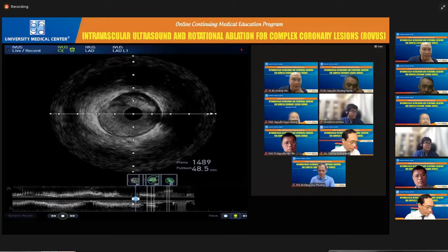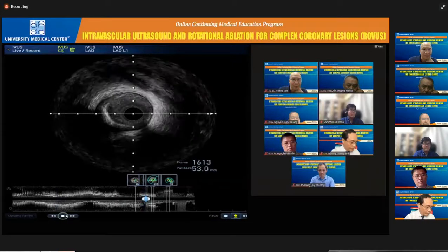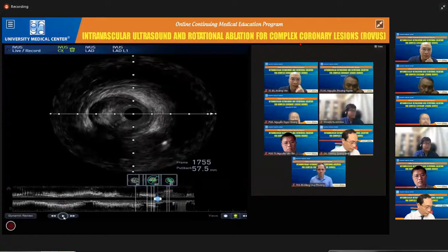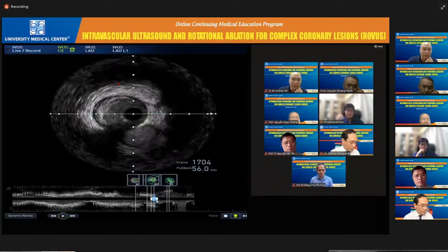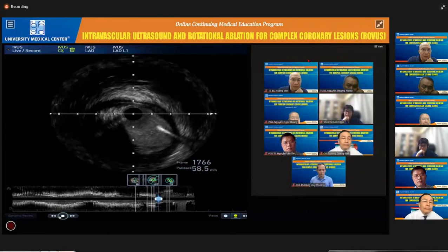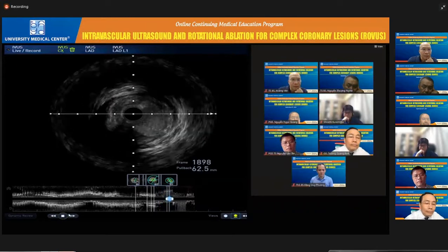Just a little bit of negative remodeling in the proximal segment. And this is the OM. This is the ostium. Please measure the ostium segment and the distal left main, please. Khoan measure, bật cái hình đo đi. Đo left main bao nhiêu?